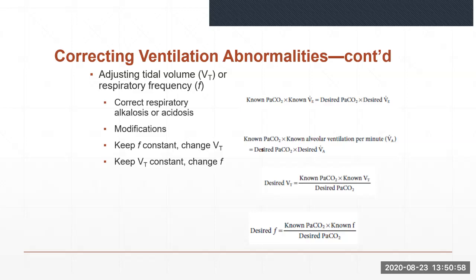With pressure control CMV, the set pressure is generally adjusted to obtain the targeted tidal volume. PCCMV is time cycled. If the inspiratory time is short, increasing it may also increase volume delivery without requiring an increase in pressure.